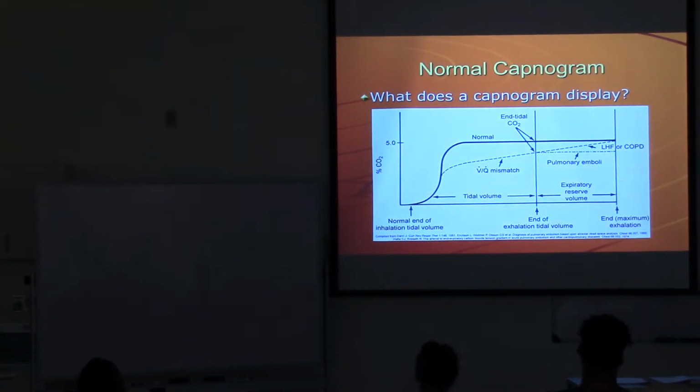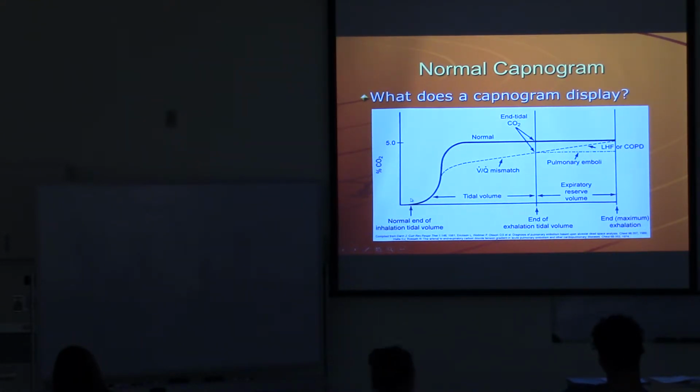What does a capnogram display? It looks a little busy. Let me just cover a couple things here. So when you breathe in, I'm going to go too fast. Let me slow down.